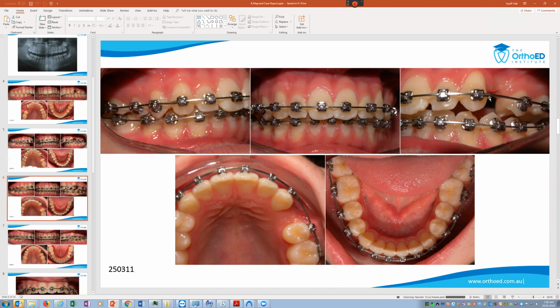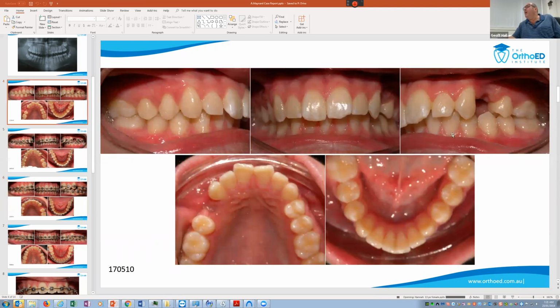Should you have put the crimpable stop back by the width of the crimpable stop? Oh, I think 1 to 2 millimetres, yeah, which will probably be about the width of the crimpable stop. But there's no actual science to that. They look nice. Well, they're straightening up, okay, and they're straightening up. But I have got this.